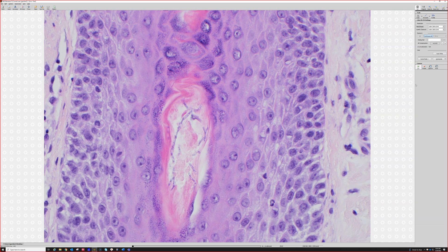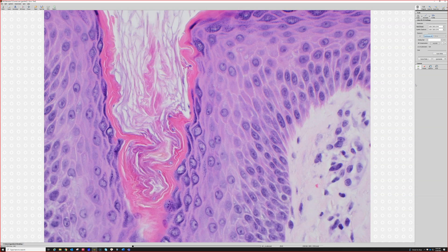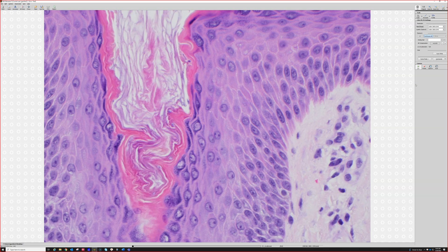Malassezia or Pityrosporum and also Candida are almost always bluish-purple. But every once in a while — and I don't know why — I'll see dermatophytes actually show up and be visible as a purplish blue on H&E. But most of the time in my lab, at least in my experience, they usually are clear. But you can see them here.